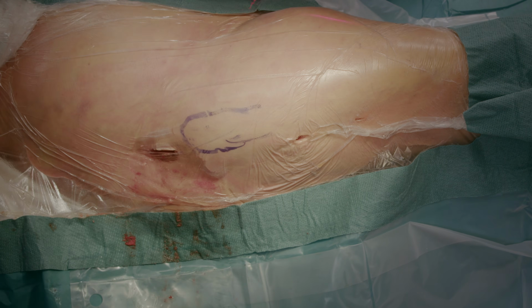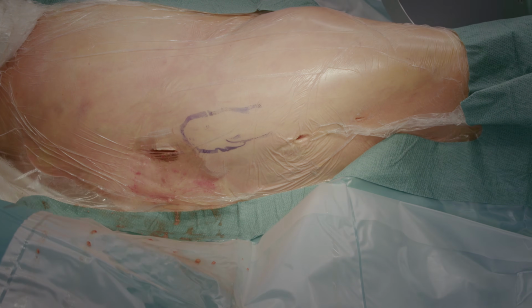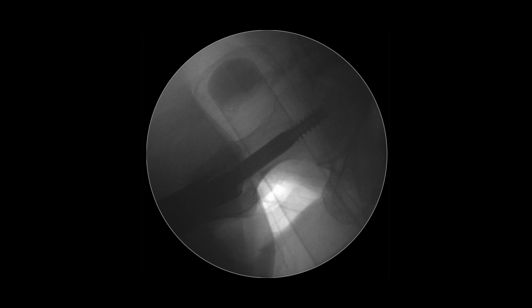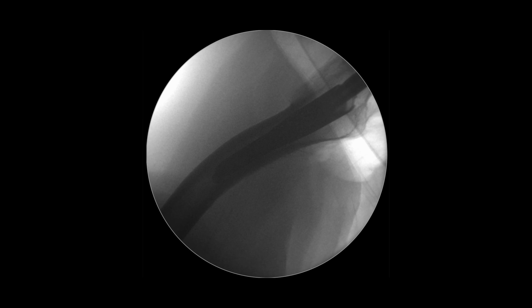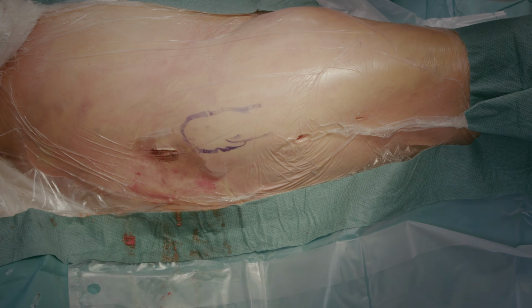Then the true lateral image by tilting the C-arm 15 degrees. We bring it a little more distally here. We see the distal end of the nail. And now we move the C-arm aside and start wound closure.